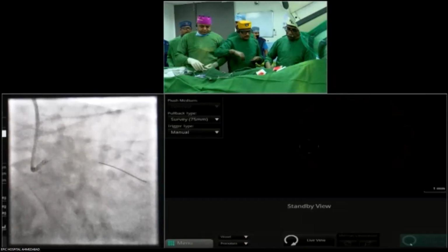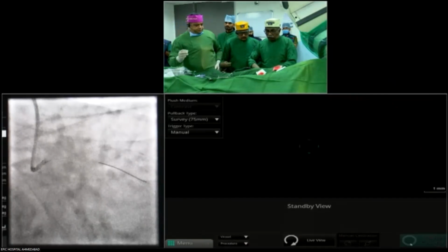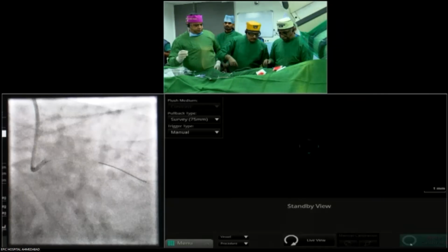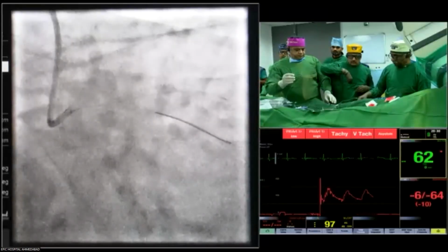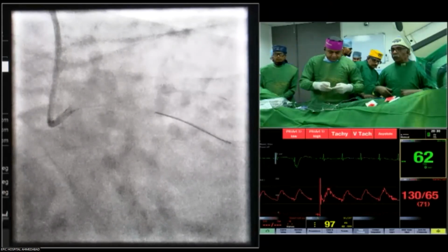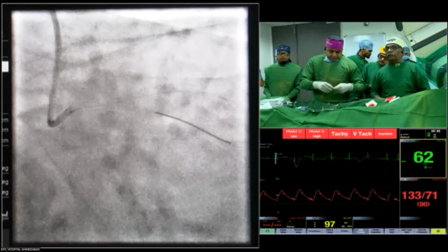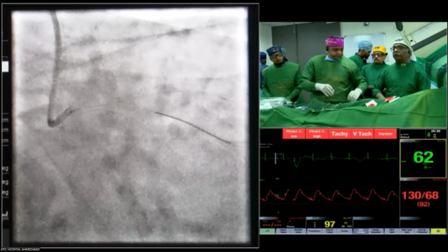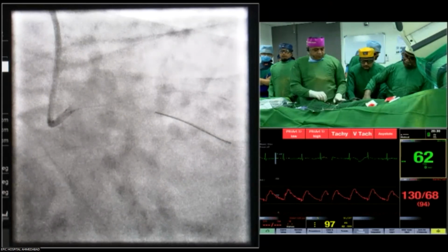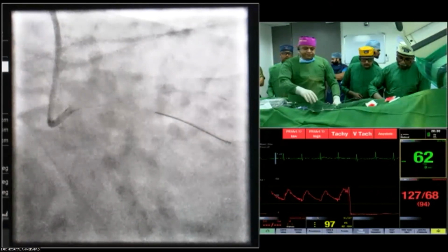So what is the house opinion? Like, did we do the right thing, or would anybody have gone crossover from left main to LAD in this situation? I want to see the imaging. Anyway, you have done it, so now we have to see the imaging and understand that. Just giving the anatomy, the pictures, the ostium and previous OCT before dilatation and after dilatation, would anybody have done something different or the same thing?